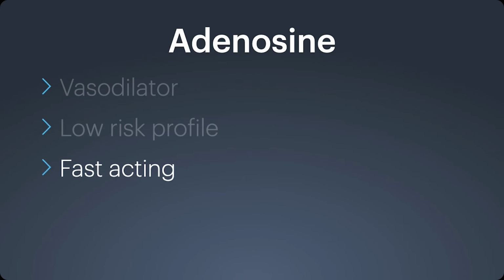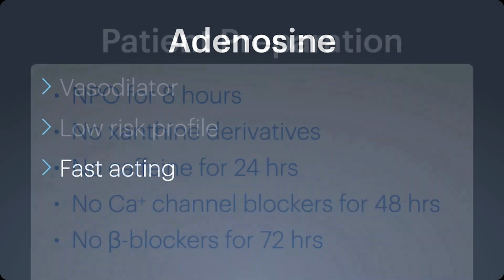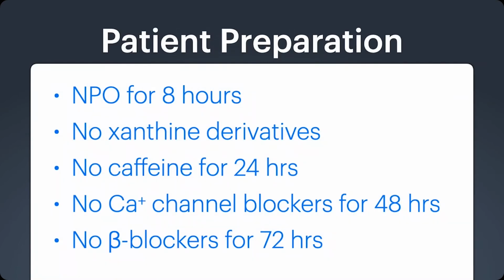As I mentioned before, adenosine is very fast acting. So if the patient does experience symptoms, it can be quickly shut off, and the effects really are diminished or go away within about 30 seconds. So how are patients prepared for the test?